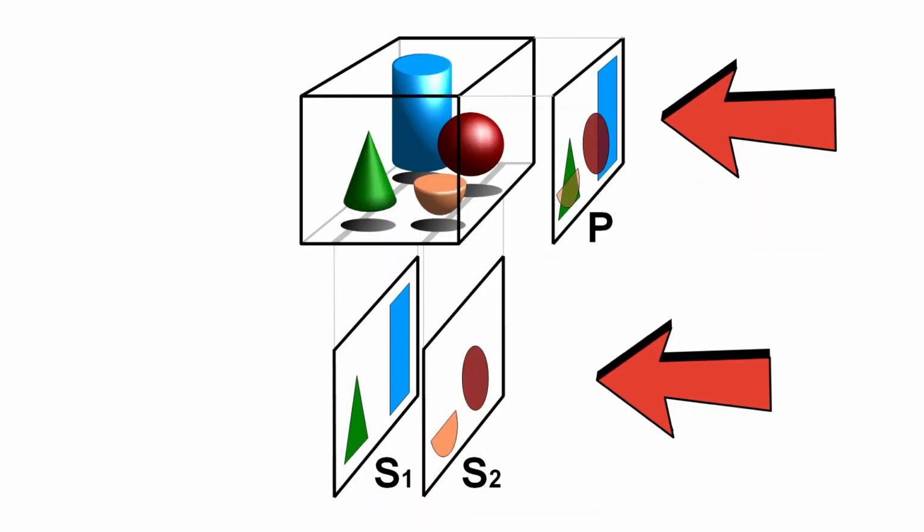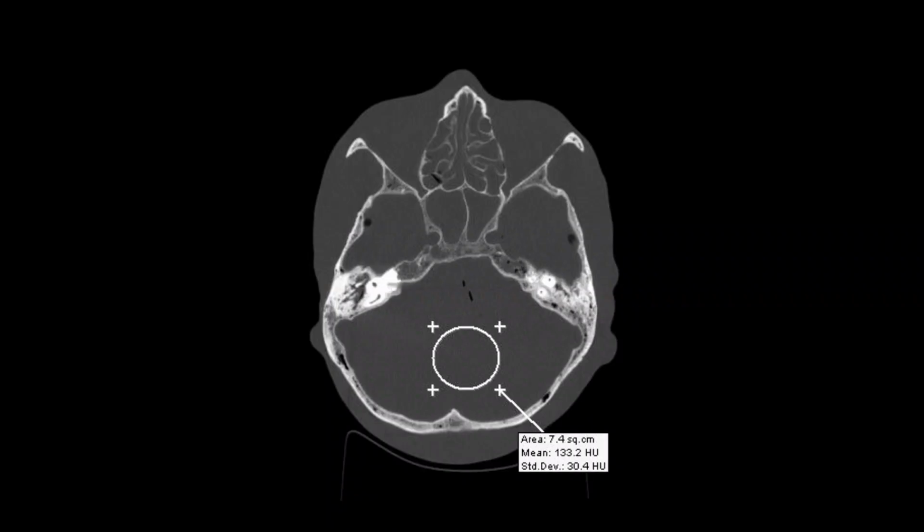You are looking at the cross section of the image. Notice the difference between the first projected image and the cross section. You are seeing the same thing from different angles. This is what is used in tomography. You would see a cross section of a part of your body.